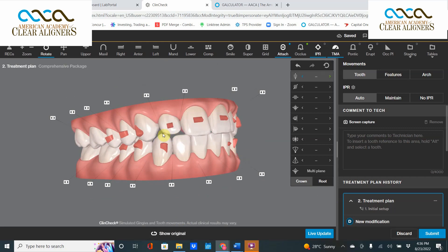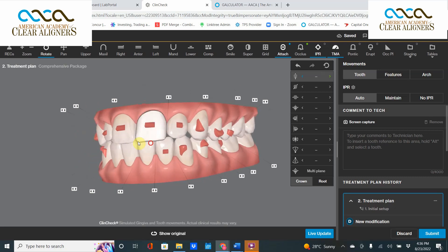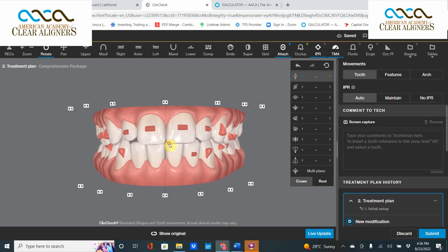If you want to close this section, extrusion is the wrong approach. Put a veneer on top of it — it's a small, tiny tooth. Here's the key takeaway: you can reduce the amount of IPR by not extruding anterior teeth in a non-open bite situation. Thank you very much, have a wonderful day.